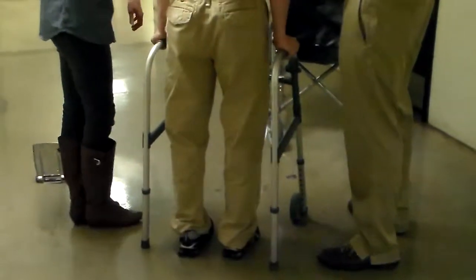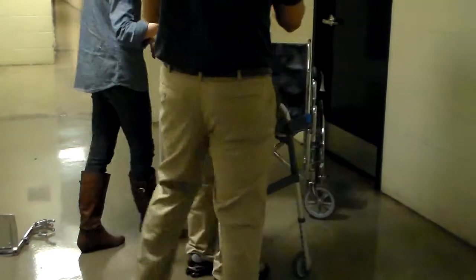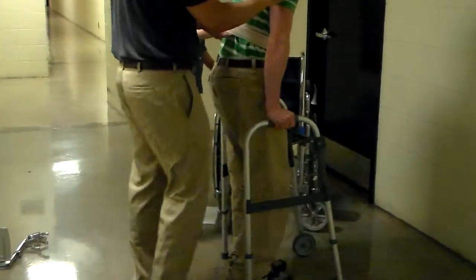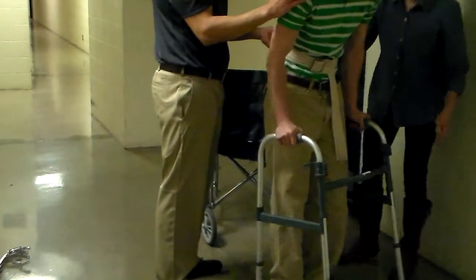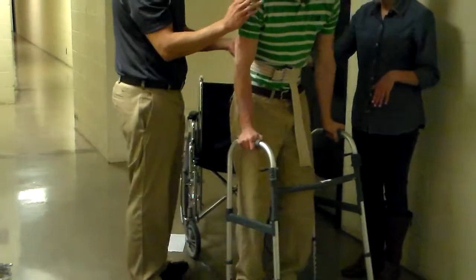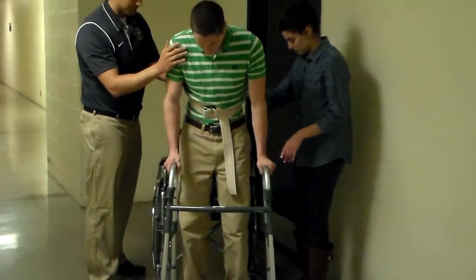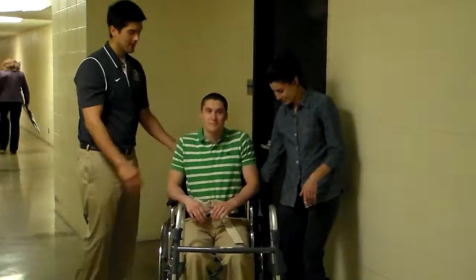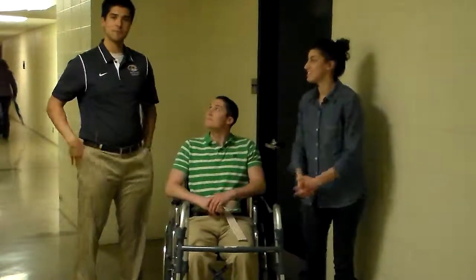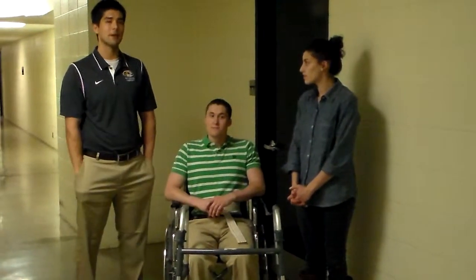So now as we approach the wheelchair, you'll again turn towards your right side. We're going to instruct Pat to make sure before sitting back down in the wheelchair that you can feel the wheelchair against the back of your knees. That way when you sit down, you'll be right in the chair. Always go back with your hands as well. Reach back to that wheelchair and lower yourself down slowly. Great job. So you just saw us show you how to use the walker along with the correct gait pattern.